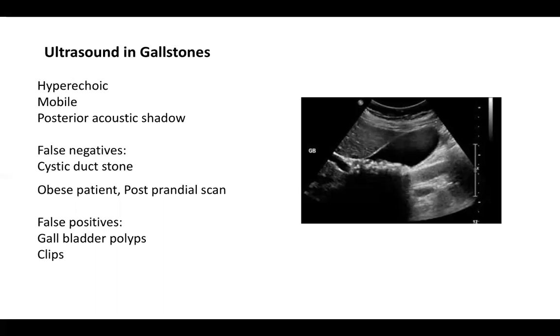Gallstones, irrespective of the calcium concentration, tend to have a posterior acoustic shadow. And the rationale behind this is the physics of ultrasound. Ultrasound waves are bounced back because of the gallbladder stones, and therefore the waves don't go beyond that. And this is what leads to the posterior acoustic shadowing.